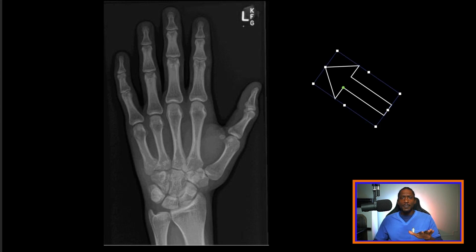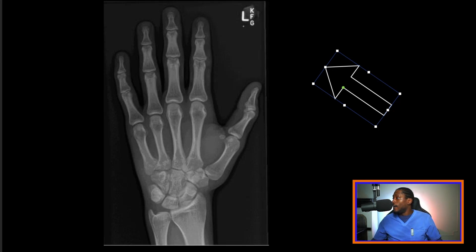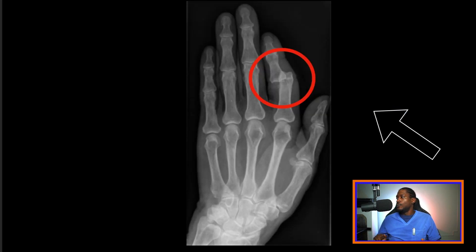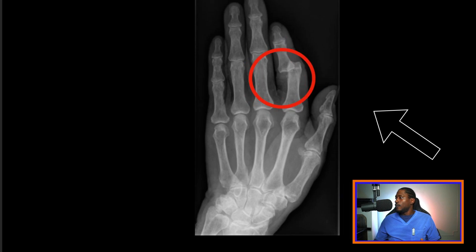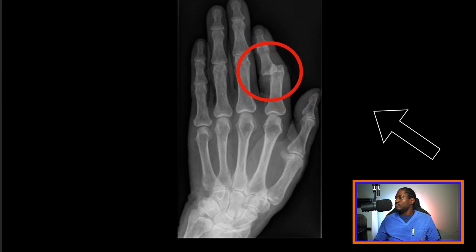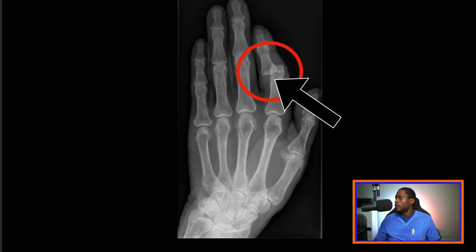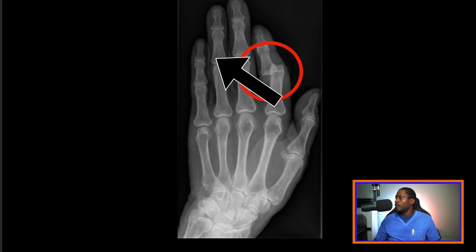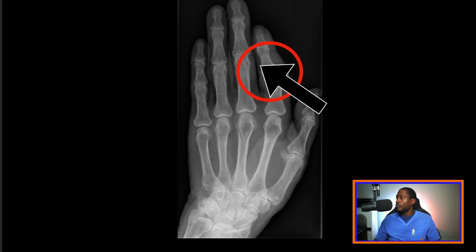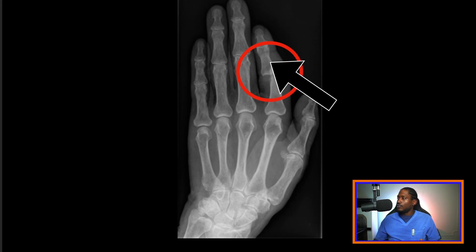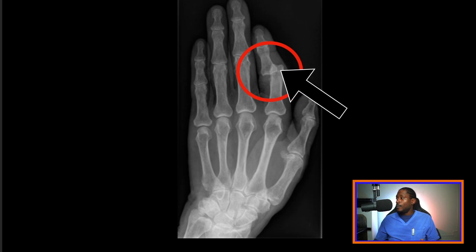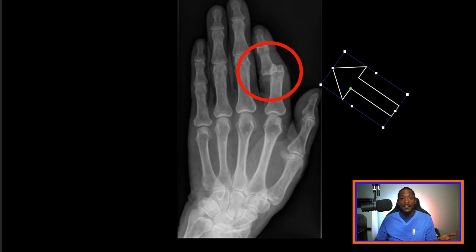This right here is just a typical AP or PA hand x-ray. PA means it goes through the back of your hand — posterior comes out through the anterior portion. This one is a perfectly fine x-ray; there's nothing going on here. Now I want to jump into one that's dislocated. There we go — you can see something's going on here. When you compare it to the other three fingers, right here is your proximal interphalangeal joint, and this one goes out of place — dislocated. This is probably a similar injury to what Peel sustained. I don't have his medical records, so I'm basically going off things I've seen in the field and what I've learned.